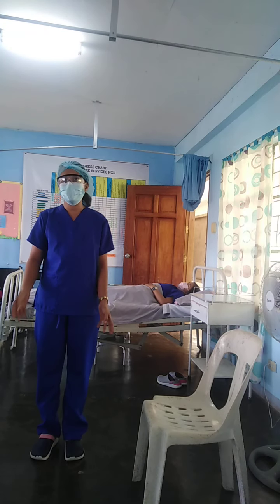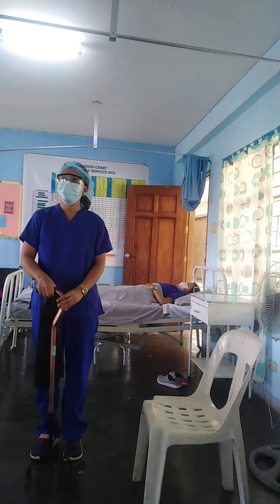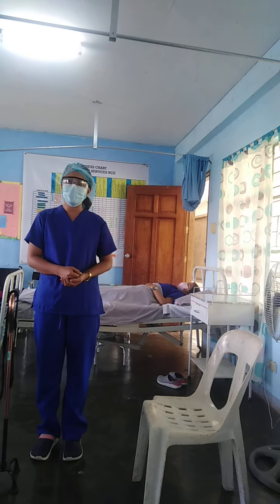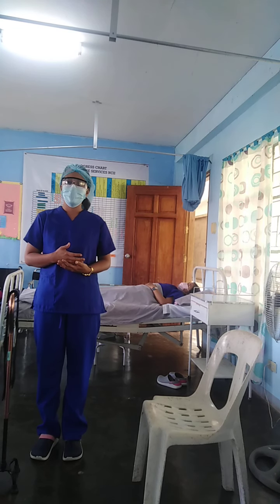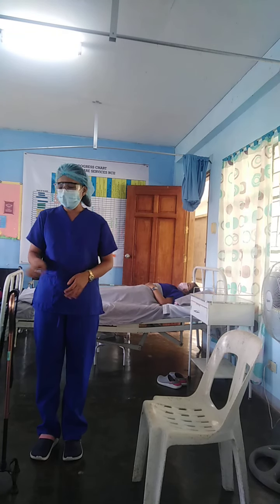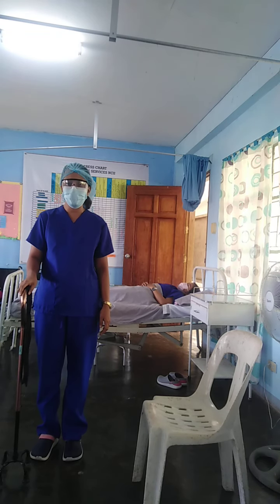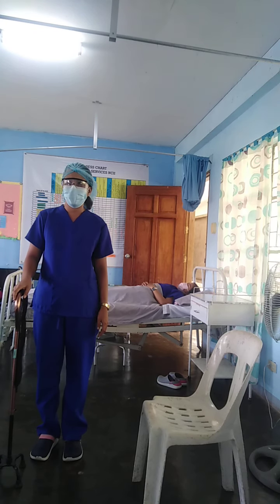The purpose of assisting patient in mobility is to use cane and gait belts. The purpose of assisting patient in mobility is to increase the patient's muscle strength and joint mobility. The use of a cane is to assist and help the patient to improve balancing and walking.